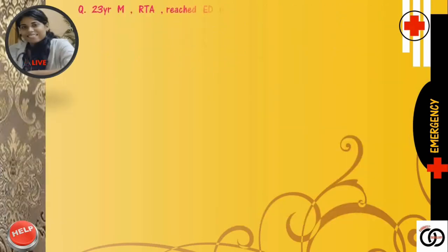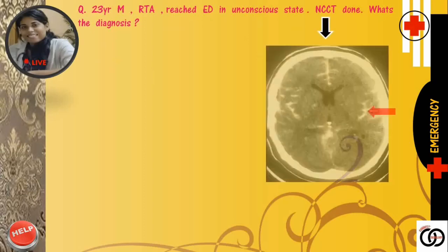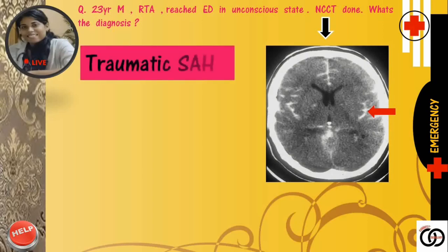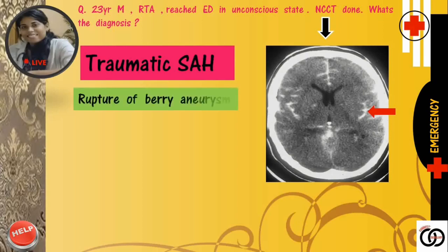Next question: A 23-year-old male met a road traffic accident and reached the emergency department in an unconscious state. NCCT was done. See the scan — can you appreciate the sulcal linear hyperdensity? These are actually the sulci filled with blood, i.e. blood is in the subarachnoid space. Yes, that's a case of traumatic subarachnoid hemorrhage. The most common cause of subarachnoid hemorrhage is trauma, but the most common cause of spontaneous non-traumatic SAH is ruptured berry aneurysm.